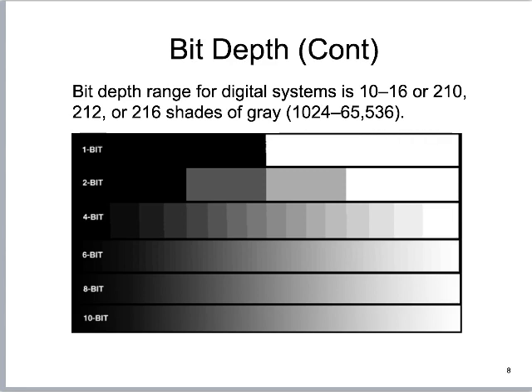If it has a bit depth of 4 now, it's 2 to the power of 4, more and more and more. It grows exponentially, right? To where eventually we wind up with things that, oh wow, that starts to look continuous to me. That almost looks analog again. It's not. It might appear that way to the human eye, but the computer sees all of these shades of gray. Every last one of them. Even ones that I can't see because of the limitations of the human eye.